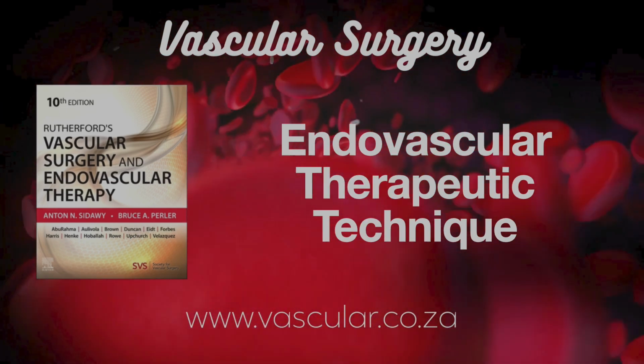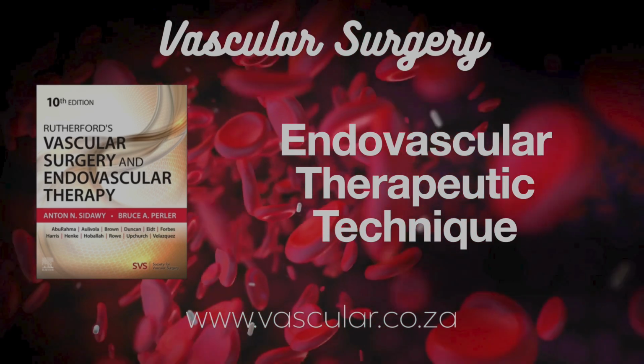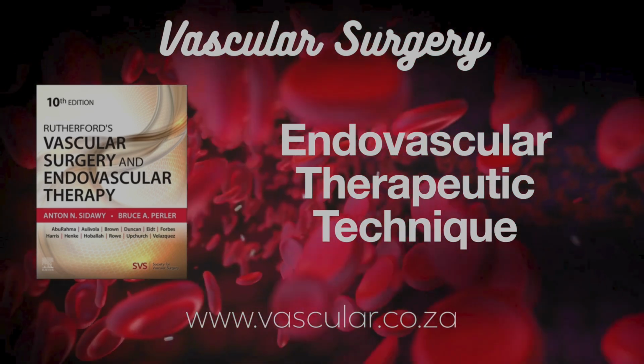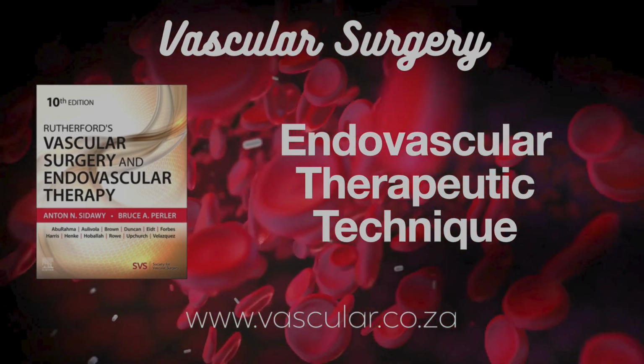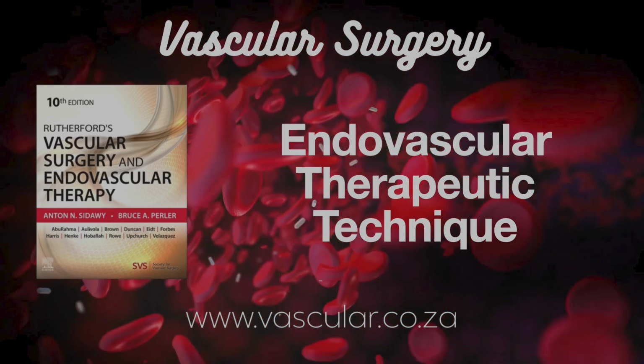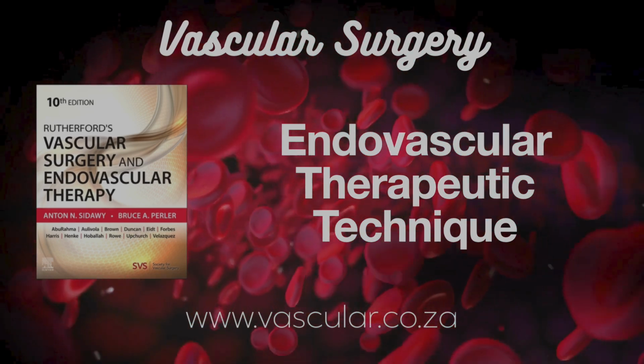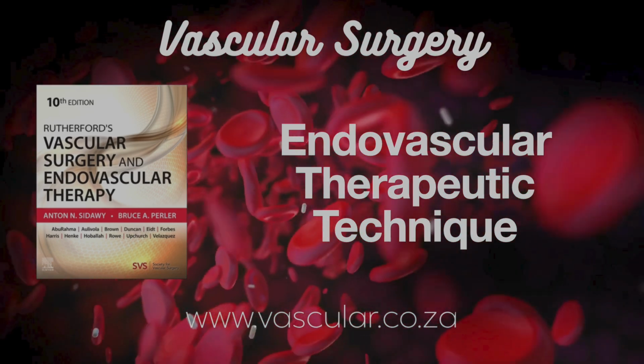Retrograde techniques, coming from below. Usually tried after antegrade fails. Access distal to the blockage, work backwards. Pedal access in the foot is common now for critical limb ischemia. Increases success but needs care regarding wound healing. Success rates around 85%. Can even go via collaterals, transcollateral, or the pedal arch, transpedal arch in complex cases.